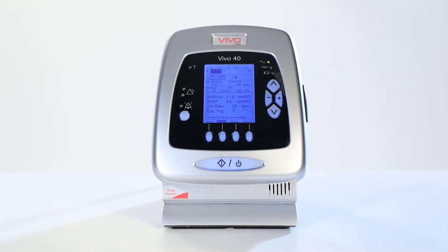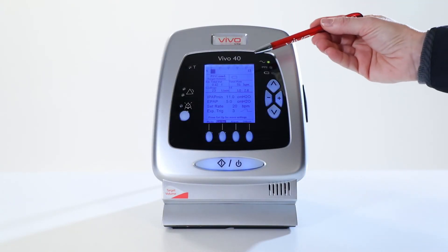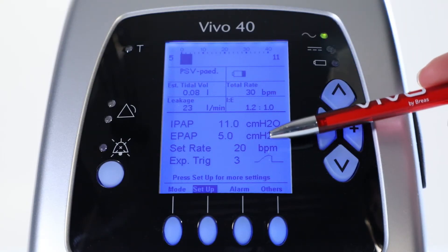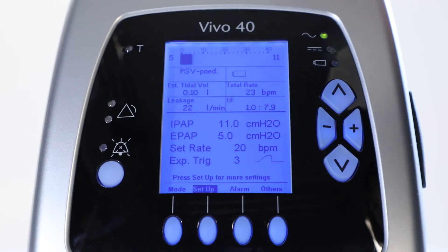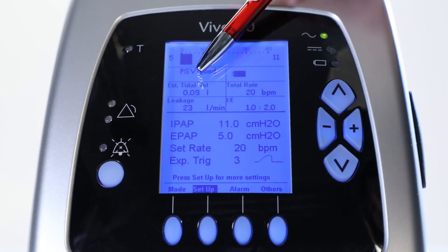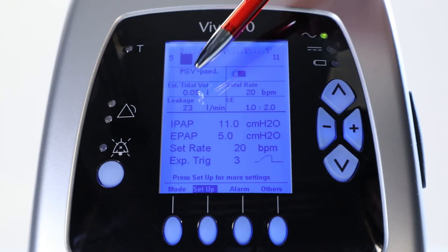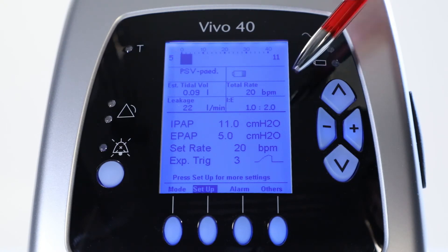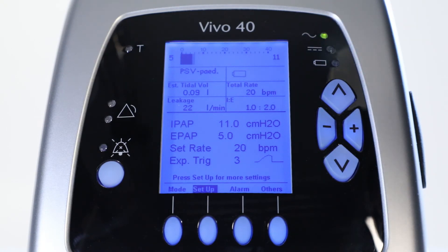The display window is now divided into two parts: the monitoring section on the top and the adjustable settings below. You can find and read measured parameters such as the pressures on the side of the bar graph, the delivered tidal volume, the leak value, the total rate, and the IE ratio. The Vivo40 now tries to reach and maintain the set pressure until the inspiration time expires or when the limit for the high pressure is reached.